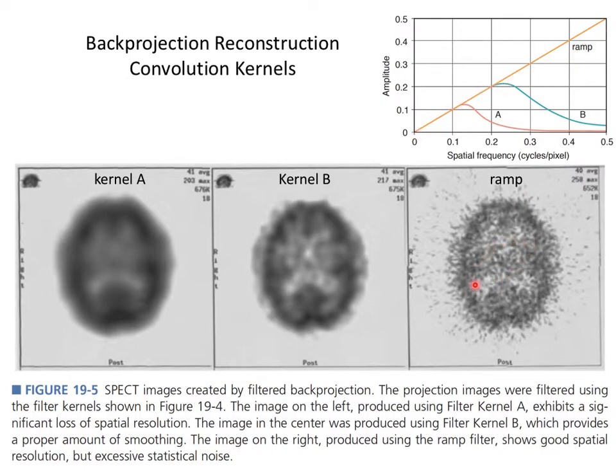However, as you can see, when you do this convolution, you get images that pass very high frequency data, but it looks really noisy, because all this high frequency data came through. So normally what's done is the raw data itself has a cutoff or a smoothing, and you get images that look like this.